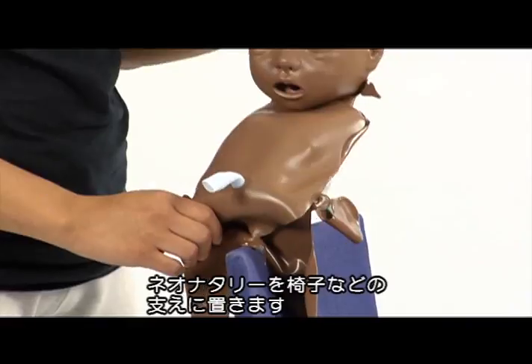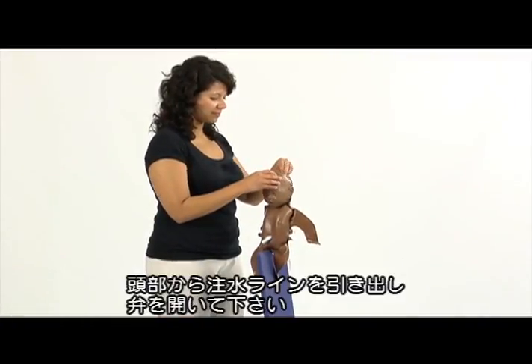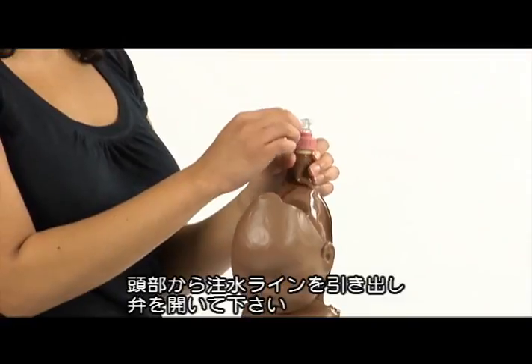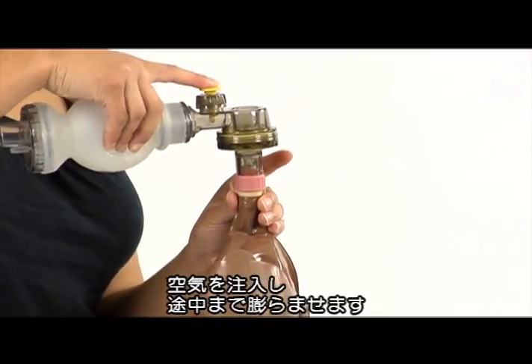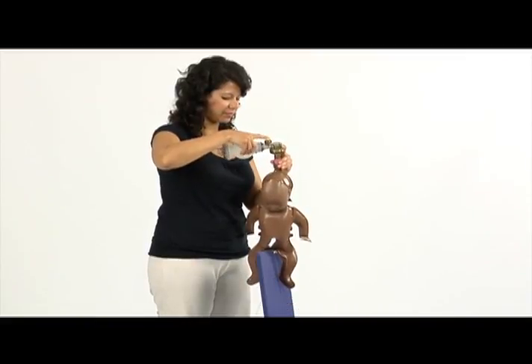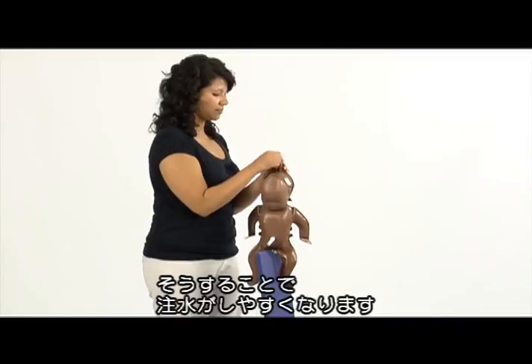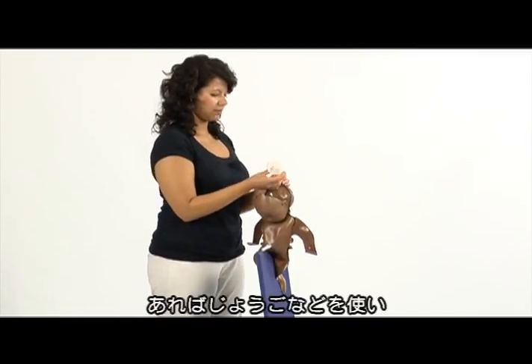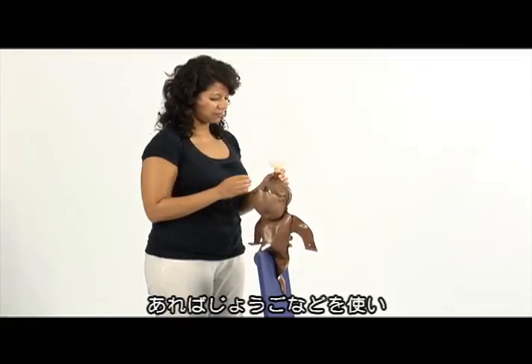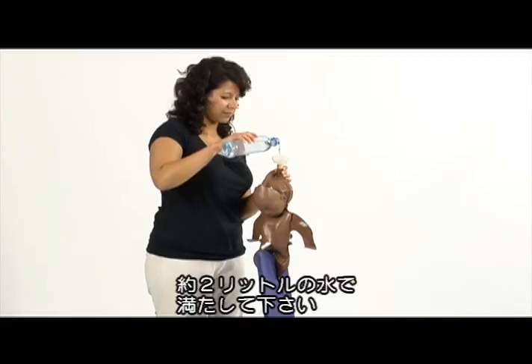Place Neo Natalie across a chair or similar to provide support. Pull out the filling extension from under the face skin and open the valve. Blow into the valve and inflate until the body is partially inflated. This will separate the foils and allow for easy filling with water afterwards. Unscrew the filling cap. It may be practical to use a circular mask as a funnel while filling with approximately 2 liters of water from a tap or suitable container.